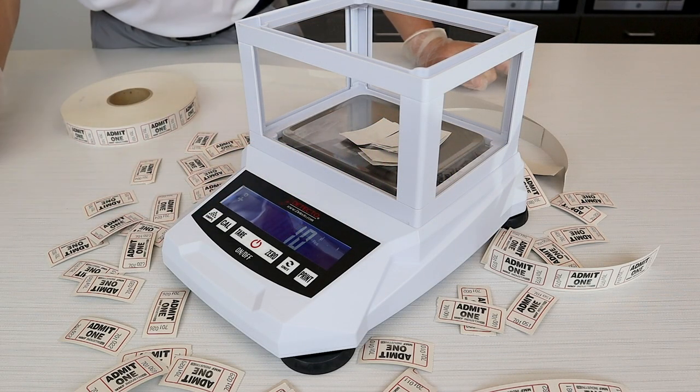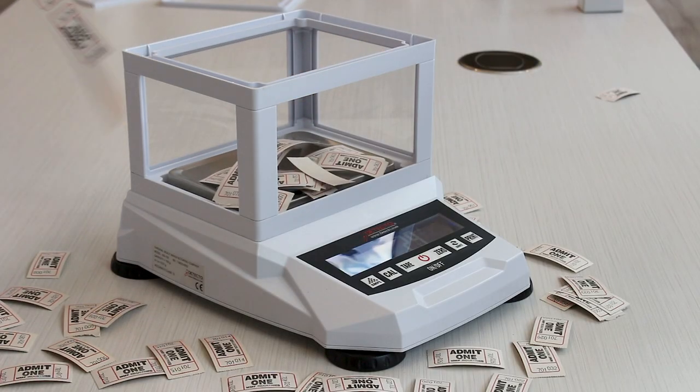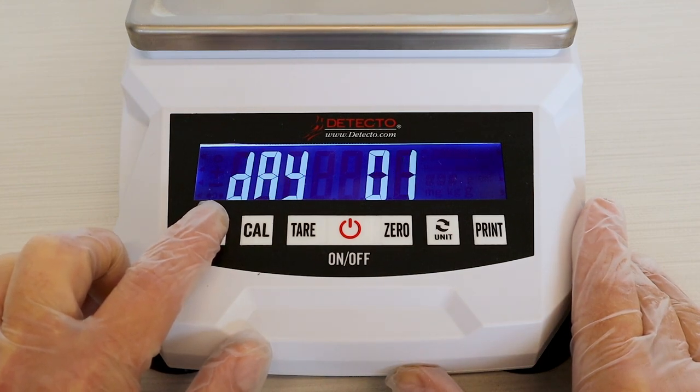The 420 series can be used for inventory counting by pressing the sample keys, counting items as small as minute parts, ingredients, prize tickets, and game tokens. You can set the date and time with a real-time clock, which is useful when the scale is connected to a printer.